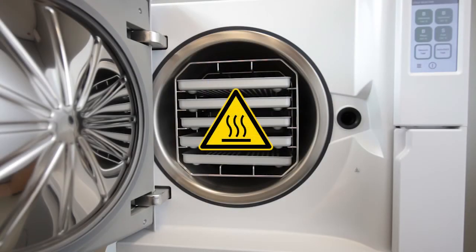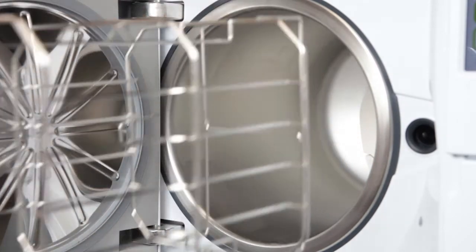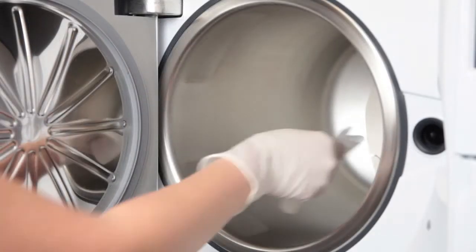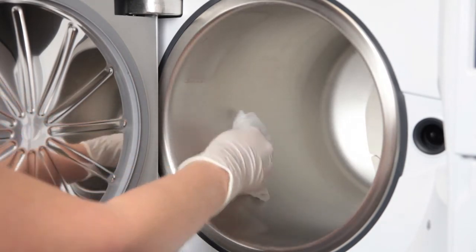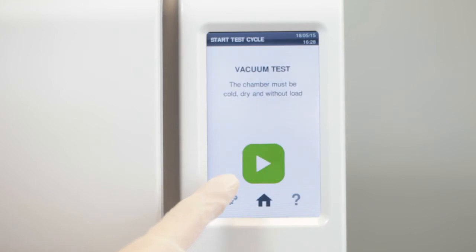Before carrying out the vacuum test, make sure that the sterilization chamber is completely dry and cold. Remove the rack and all storage trays. Check that the sterilization chamber is completely dry. Close the door and select vacuum test from the cycle selection screen.